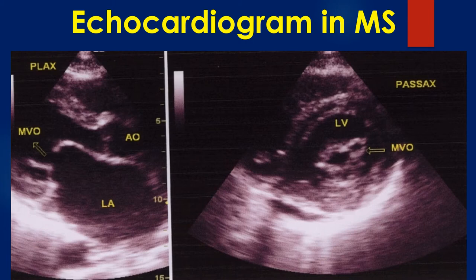The mitral orifice is seen within the cross section of the left ventricle. The anterior and posterior leaflets are seen in cross section and are thickened. The commissures are fused. Parasternal long axis view will give an assessment of the subvalvar apparatus. Subvalvar fusion may result in poor results after valvotomy as they can produce secondary obstruction beyond the valve.